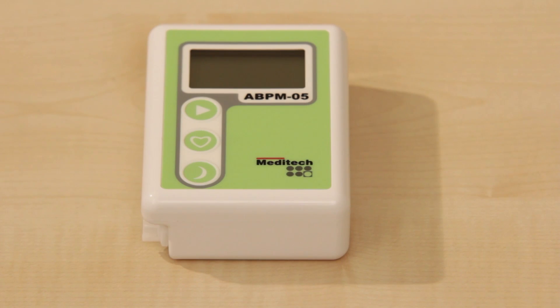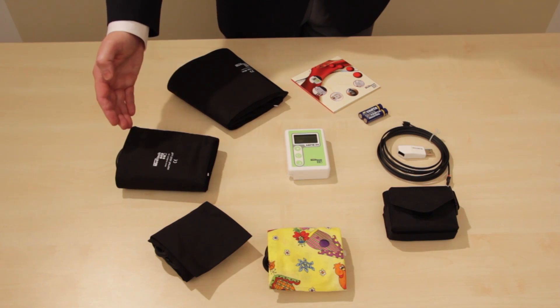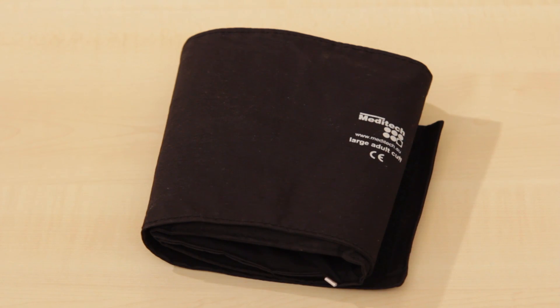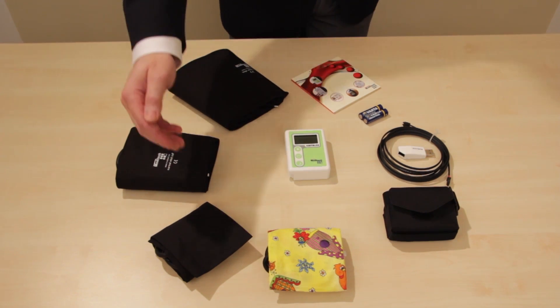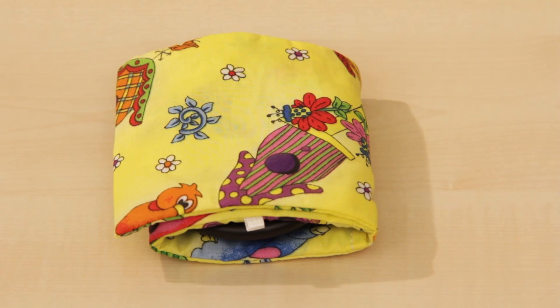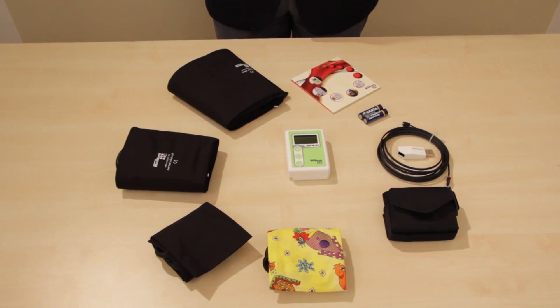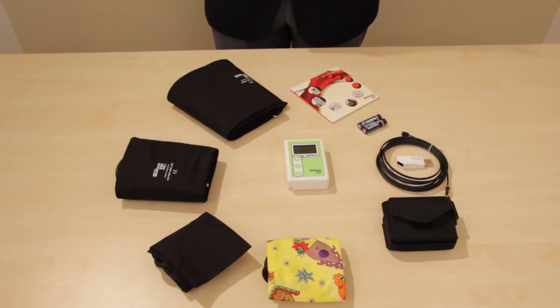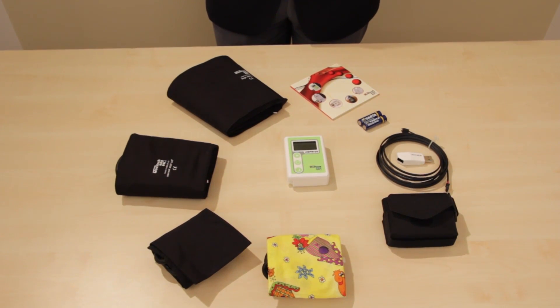This is the device itself, which is usually delivered with a normal size cuff. Optionally we have a large size cuff for larger arm circumference patients and a small size cuff for small adult arm sizes, which also comes in a patterned version, a favourite for children. There is a small pouch in which you insert the device before applying it to the patient's waist, which comes together with waist and shoulder straps for securing the device on the patient.